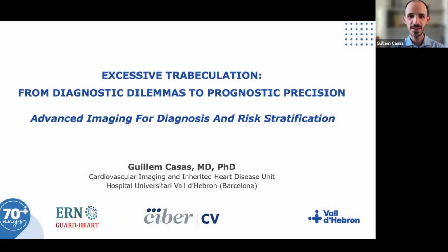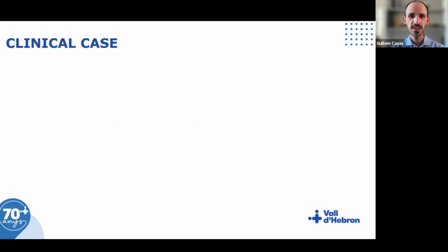Good afternoon, everyone. Thank you for joining us in this webinar, and I will talk about the role of advanced imaging for the diagnosis and risk stratification. I will start with a very simple case, but I think this is illustrative of the controversies around this entity.